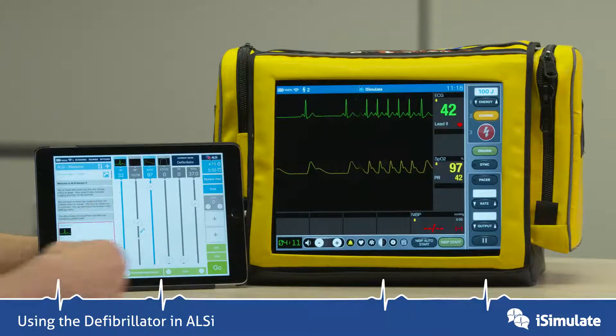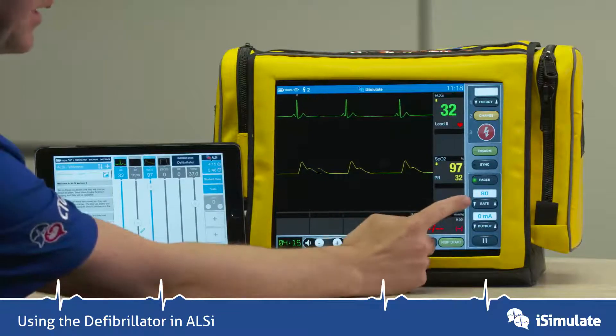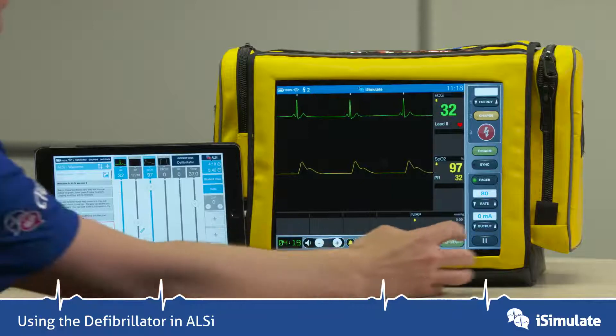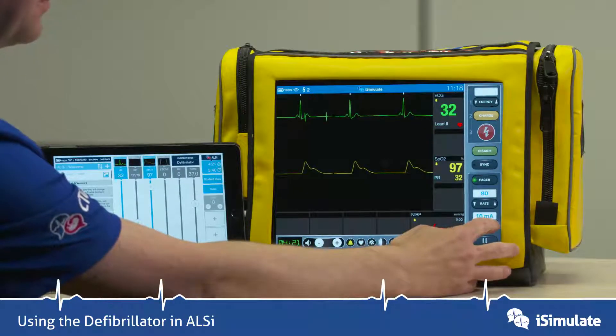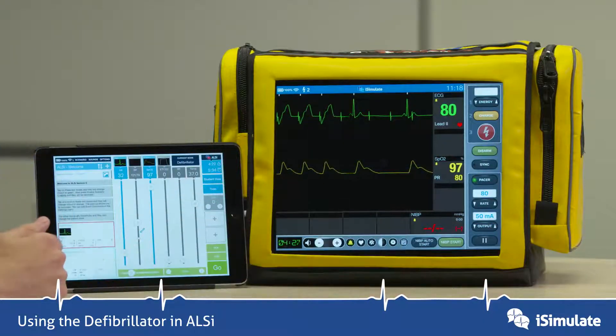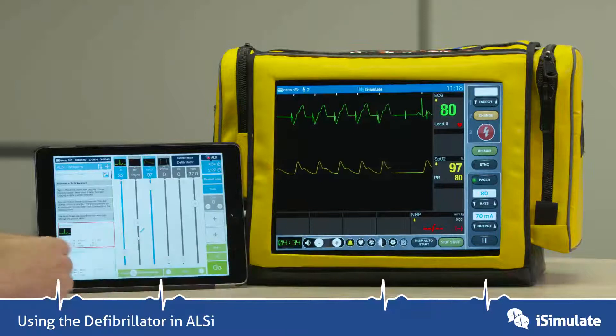Let's now go into the pacer function. We'll turn it on, and when you turn it on, a rate appears — default of 80 — and an output appears. If we increase the output, we will eventually get capture. You can see some partial capture appearing here, and if we go up a couple more milliamps, we get complete capture.